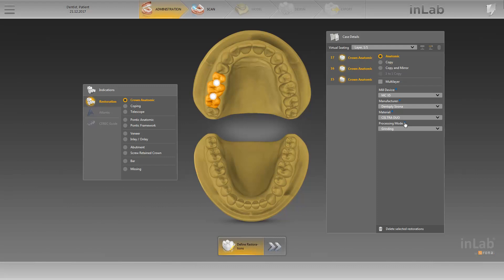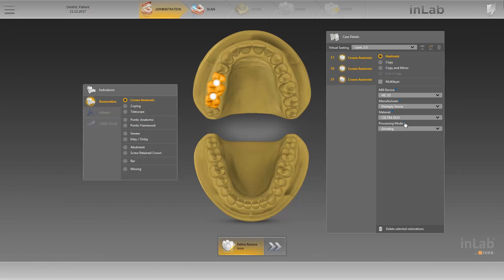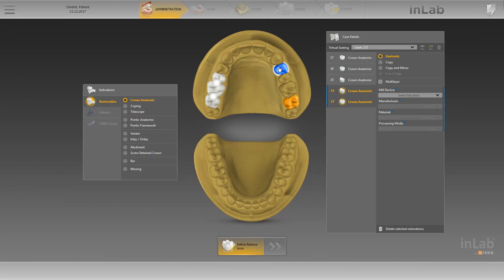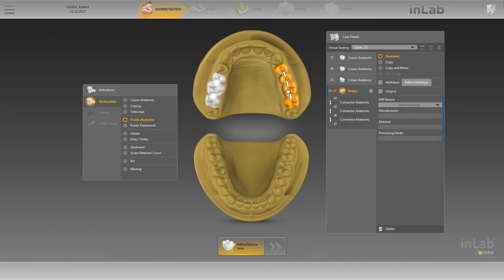Next, we will create a new restoration in the second quadrant. We make sure that the option crown anatomic, under indications on the left-hand side of the window, is active, and select the crown on 2-7 in the odontogram. We place the second crown on position 2-4. To define the pontics, we activate the pontic anatomic option and click on our pontics on 2-5 and 2-6 one after the other. The in-lab software has now automatically added the anatomic connectors. Next, we will once again complete all mandatory fields under case details.